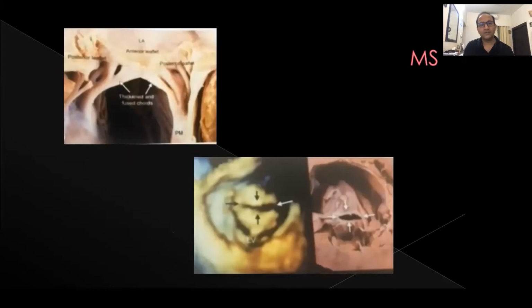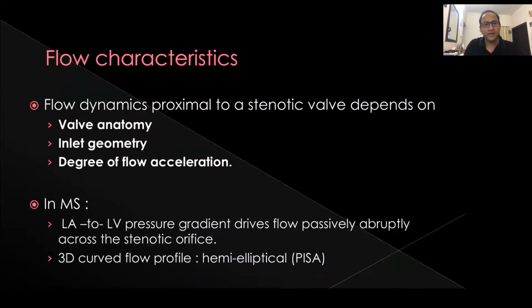Now, in a typical rheumatic mitral stenosis, you can see that these are the chordae. See how thick they are. Normally, they're really thin, thread-like structures. And in chronic rheumatic heart disease, the smoldering inflammatory process makes them fibrotic, thick, and it leads to a so-called fish mouth appearance of the mitral valve, and then, of course, associated changes, which we will discuss.